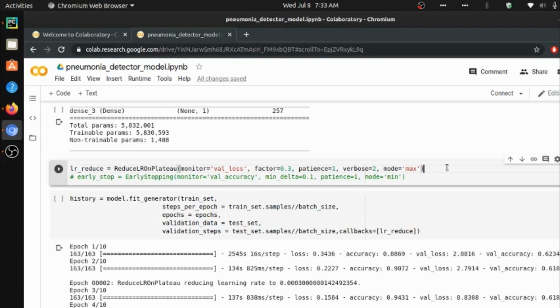Suddenly the validation loss may increase, then fall, then increase, then fall. That is not expected from our model, and the model must train in a smooth manner. The validation loss must always reduce in a gradual manner and not in a haphazard manner. Similarly for the validation accuracy as well.